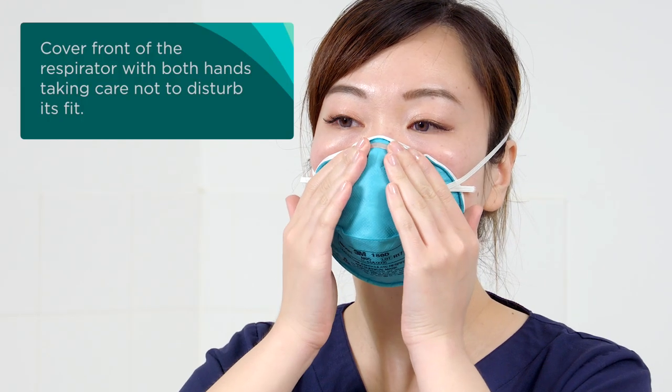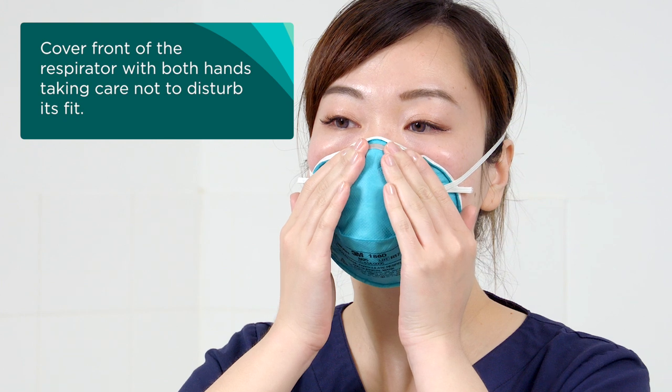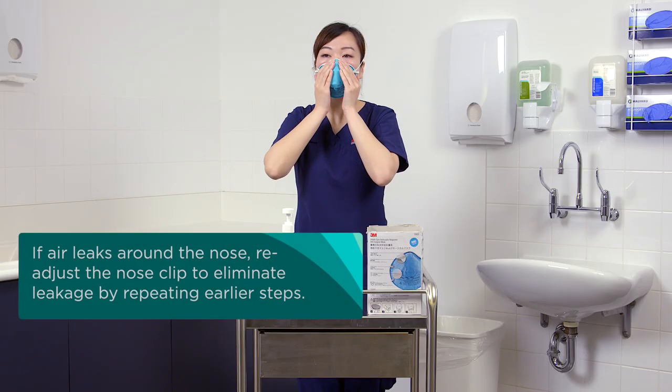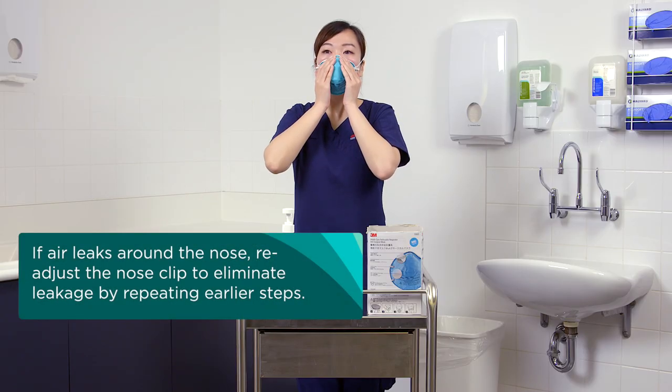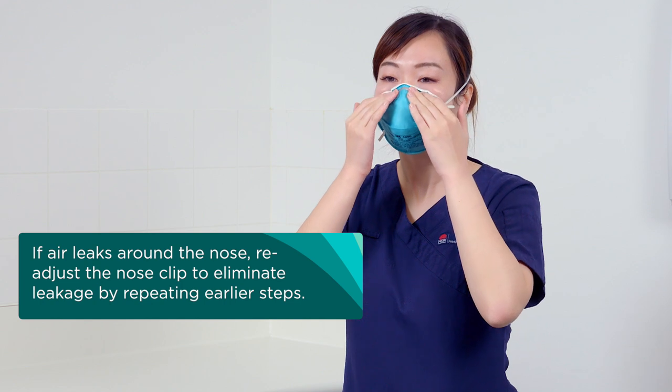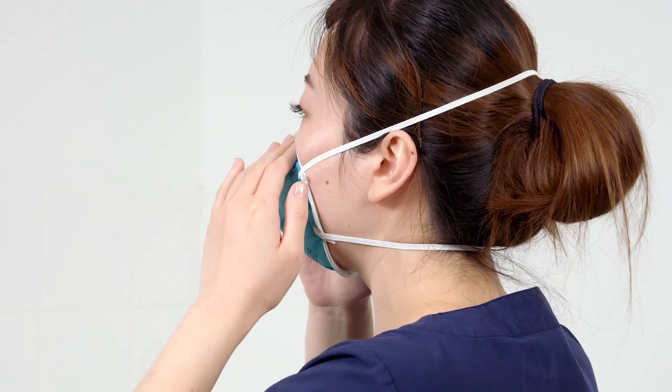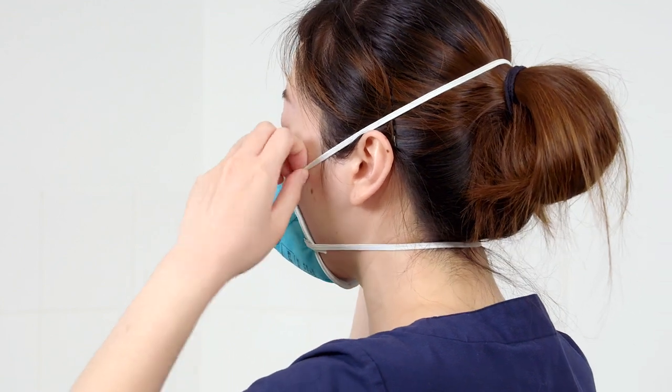Cover the front of the respirator with both hands, taking care not to disturb its fit. Inhale and exhale sharply. If air leaks around the nose, readjust the nose clip to eliminate leakage by repeating earlier steps. If air leaks at the respirator edges, work the straps back along the sides of your head.